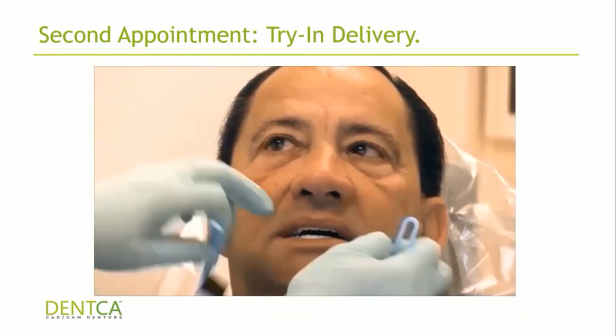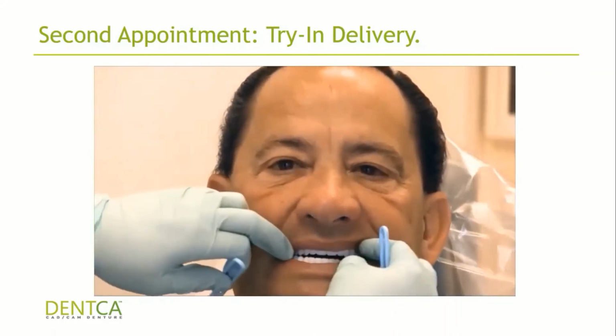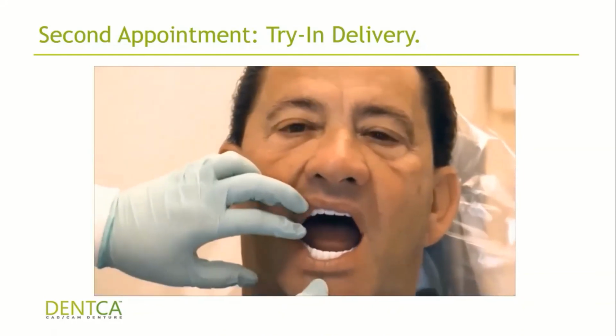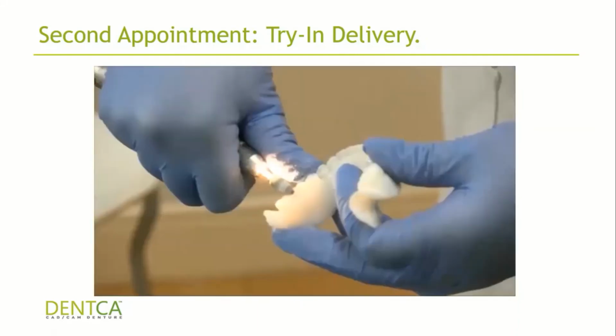So for the bite, you just basically do what you do with any regular denture. You check it on centric. If you have any occlusal issues, you use your articulating paper, and then you relieve those areas. If there are big areas, then you grind off all the posteriors and take a new bite.